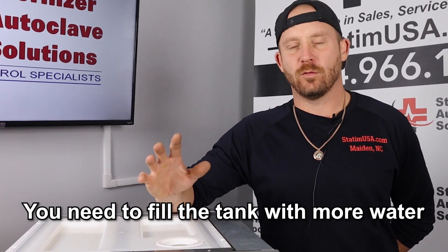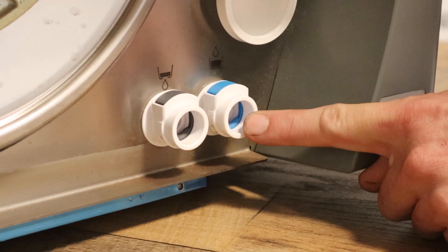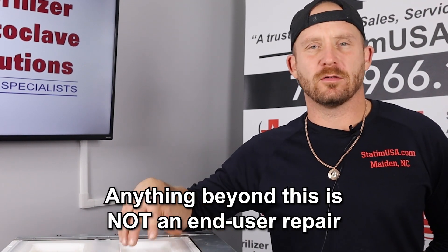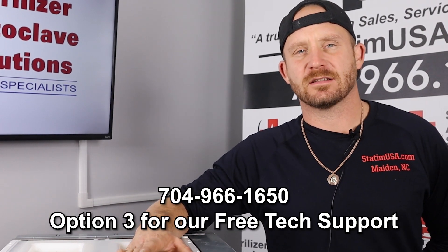You will need to add distilled water only, through one of two ways: there's a hole at the top where you can add distilled water, or at the front of the unit, if you have a manual fill bottle with a hose, you can fill it that way. If the problem persists after adding water, it could be one of the floats inside the tank — this is not an end-user repair, so please call our free tech support.